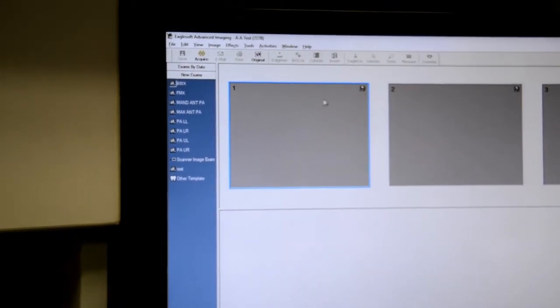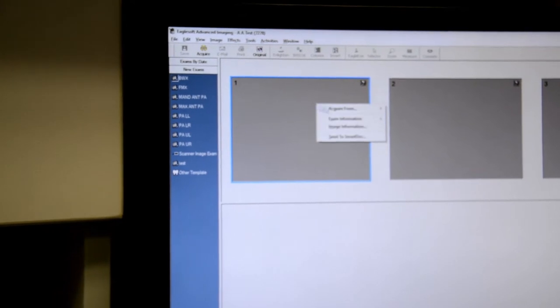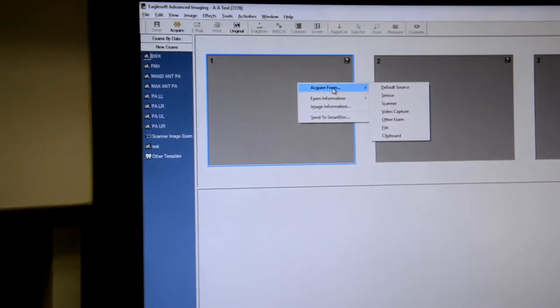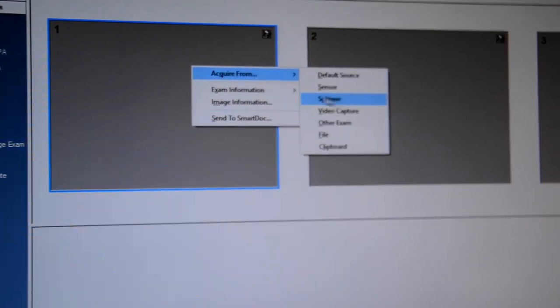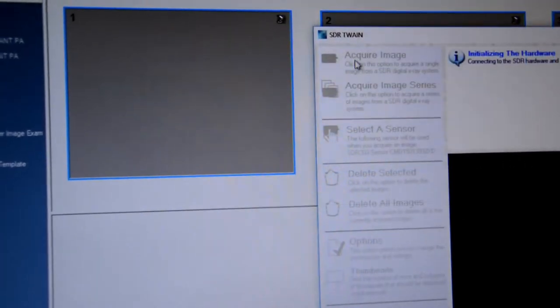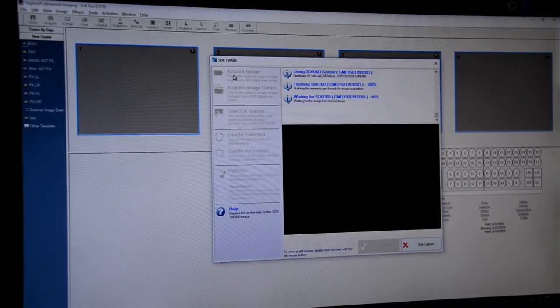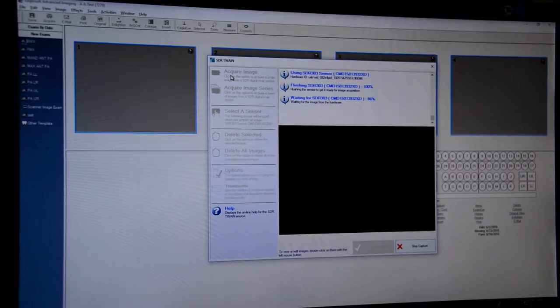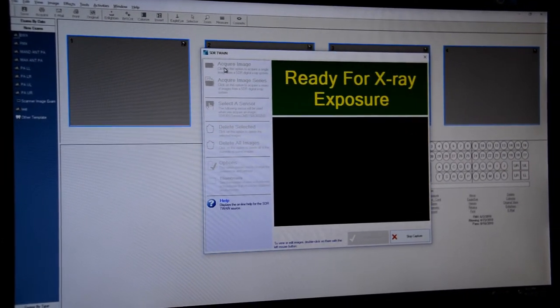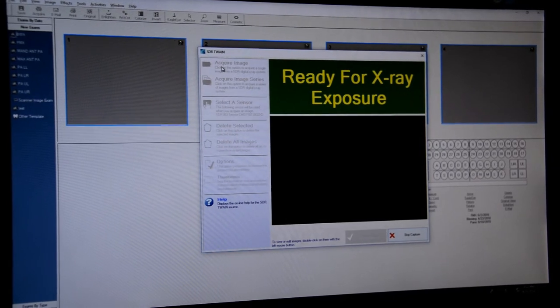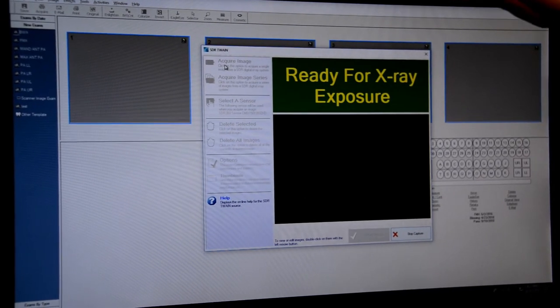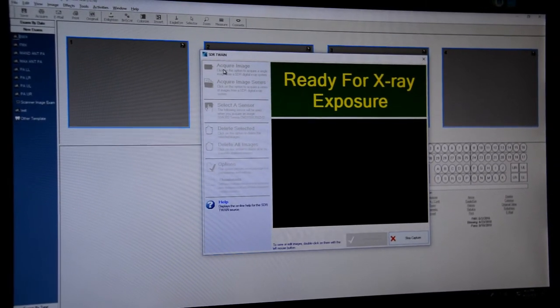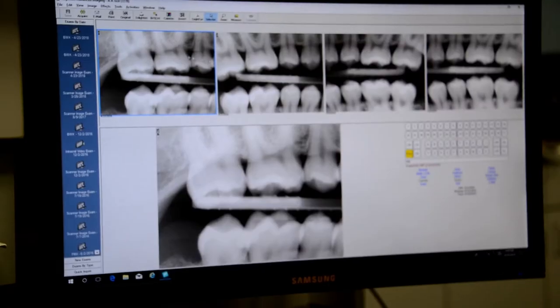From here we right click and acquire image from our default source which is also the scanner so we select the default source. It's going to open up the sensor. Once it turns green it's ready to capture. We're ready for exposure, we're ready we're in a ByteWing layout ready to take our premolar ByteWing.